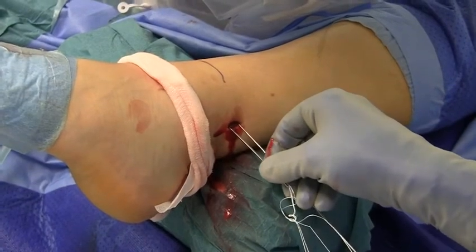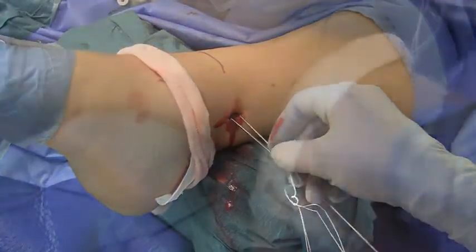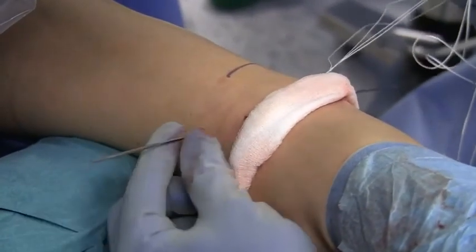The long needle connected to the suture button device is introduced into the drill hole and passed through to the medial side of the ankle.